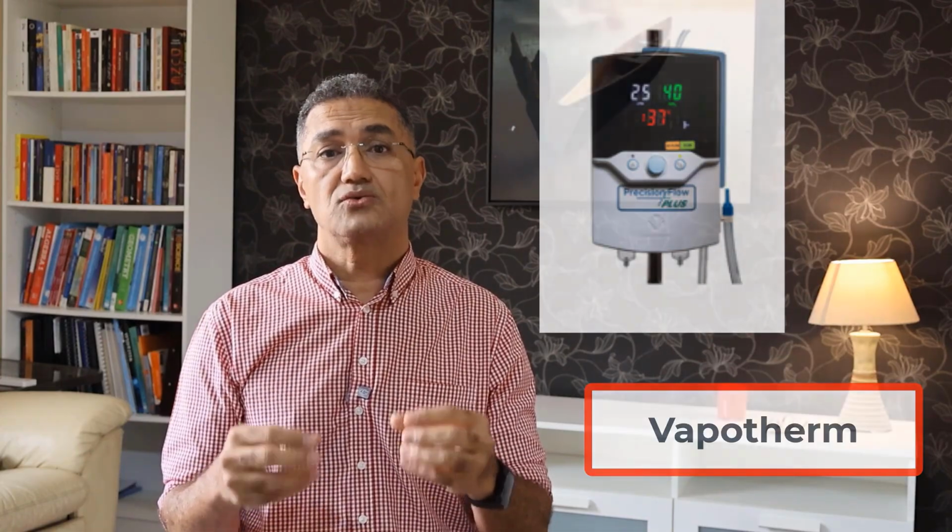The system must work extremely well and reliably for a long period of time with patients because, as we have said, any defect or malfunction in the humidification process or the heater can potentially cause problems, because the air entering the patient would be very harmful and could cause respiratory system issues, and we would end up harming the patient more than helping them.